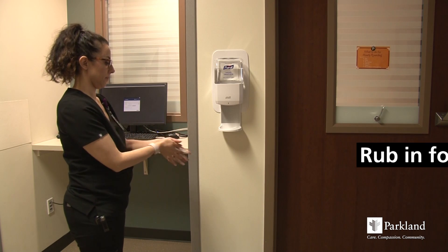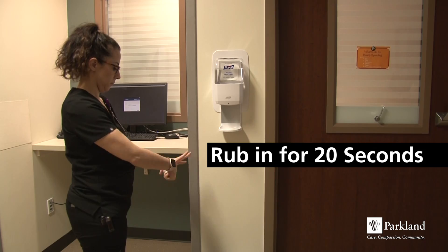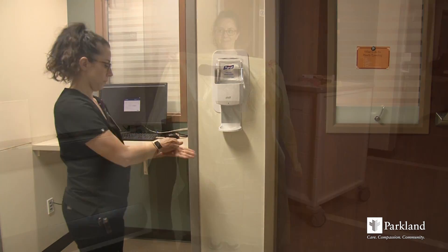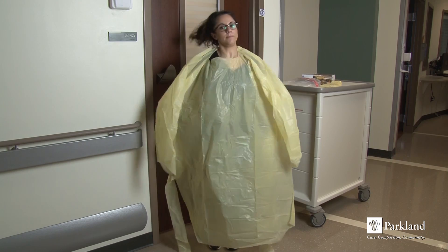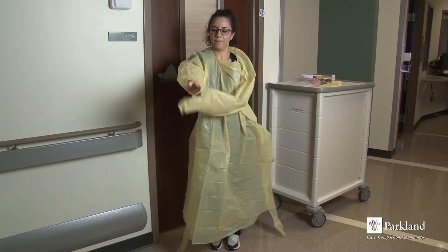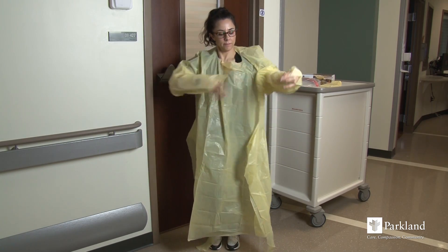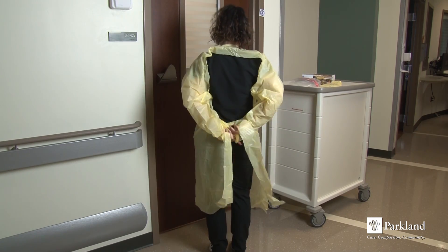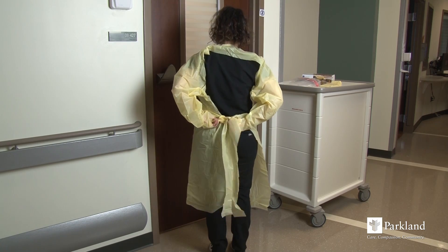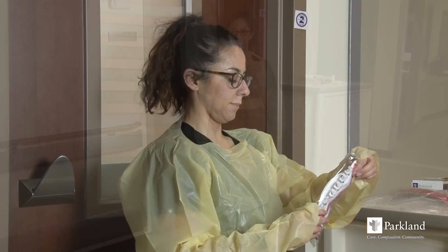Begin with standard hand hygiene. The next step in the donning order is the gown, to protect our clothing and body. Put on the gown to fully cover your torso to your knees and arms to your wrists, and tie securely behind your back.